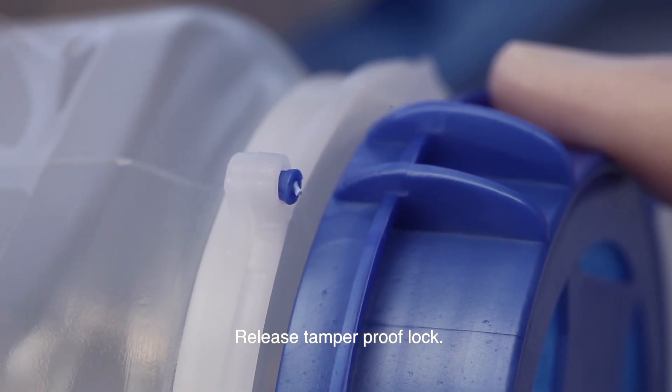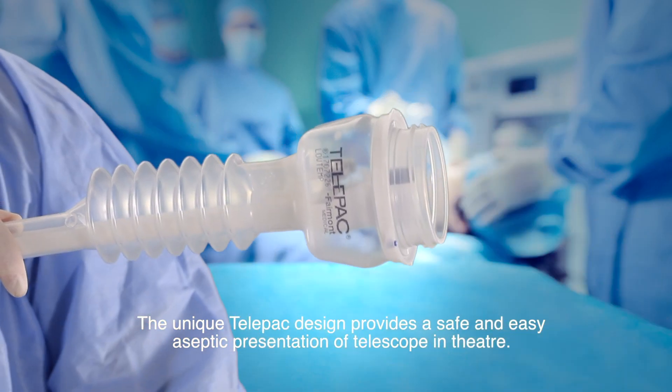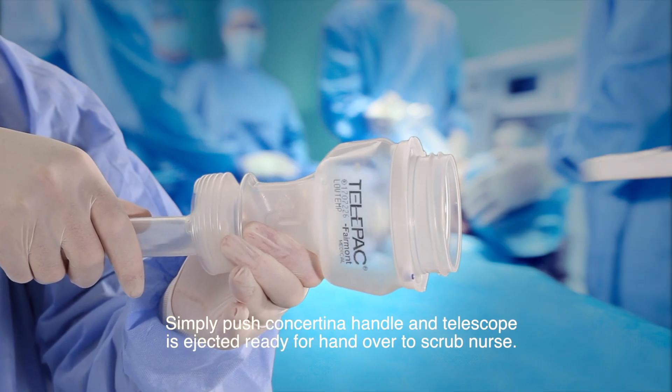Release tamper-proof lock. The unique Telepack design provides a safe and easy aseptic presentation of telescope in theatre. Simply push the concertina handle and the telescope is ejected ready for handover to the scrub nurse.